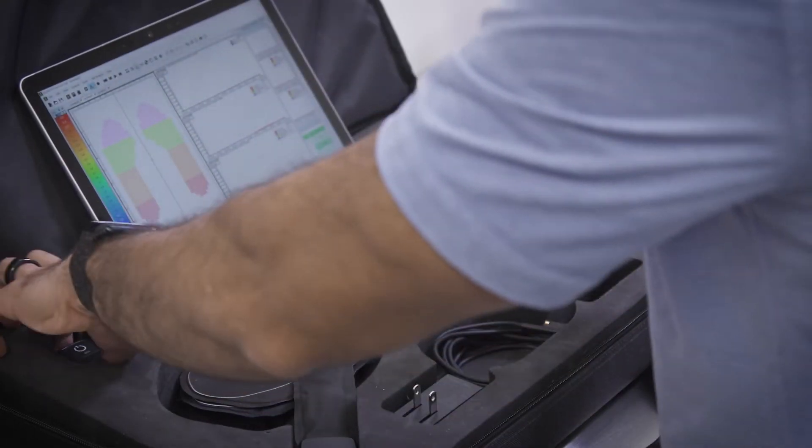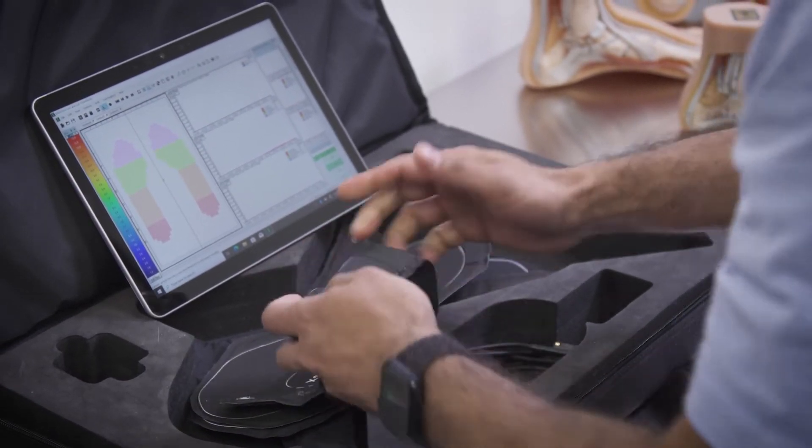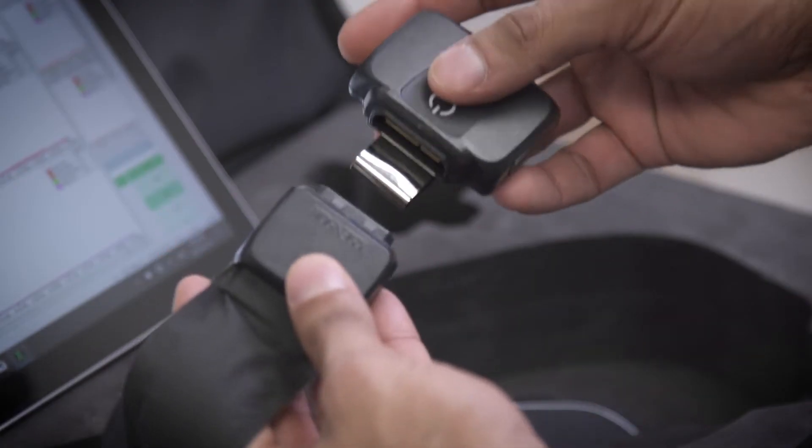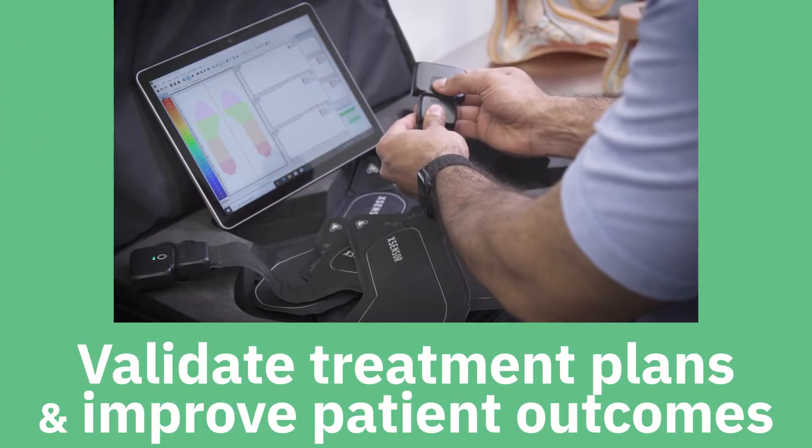XSENSOR Technologies Intelligent Insoles Clinical is a plantar pressure and gait measurement system that allows clinicians to quantify motion and footwear performance, validate treatment plans, and improve patient outcomes.